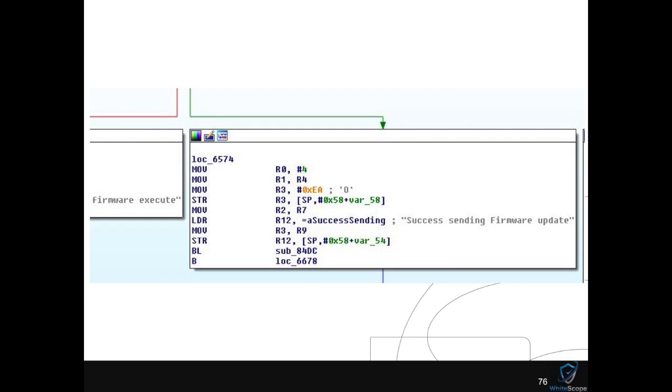So we showed the video that drove user interaction to a screen. They can probably stop that, right, depending on the architecture of the pump. But for the firmware updates, the way it's currently configured, the communications module by design has the ability to send firmware updates to the actual main pump board itself. So that's something we're always worried about.